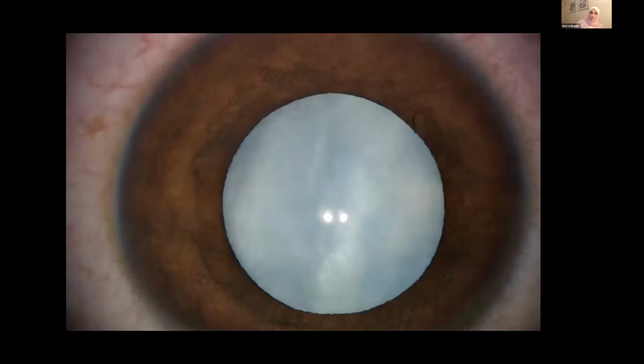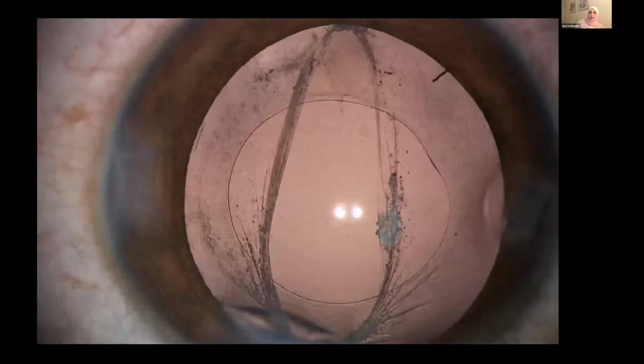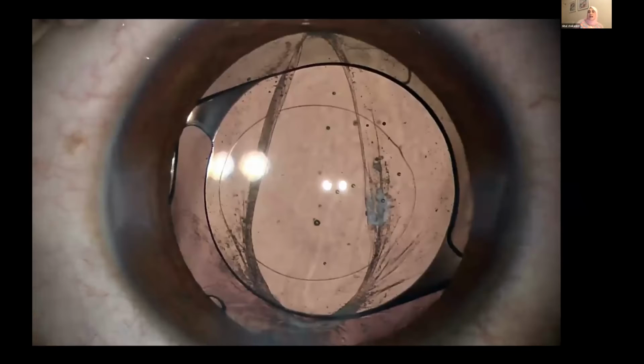In some cases, with a large defect, after vitrectomy and aspiration, we are left with a large defect, but look here, it is fibrotic and curved, the upper part and the lower part of the defect. In these cases, we can even polish the anterior capsule, and then we can inject the IOL inside the capsular bag between rexis, anterior rexis, and this is a huge defect because we have a round edge of the defect that cannot extend.